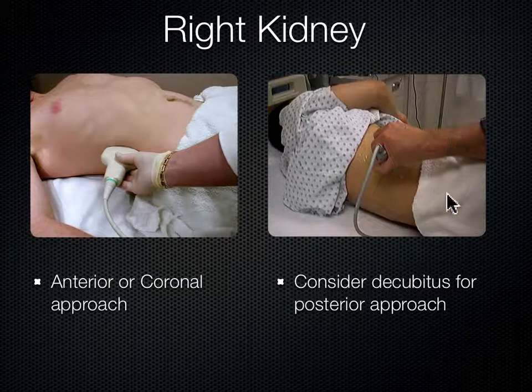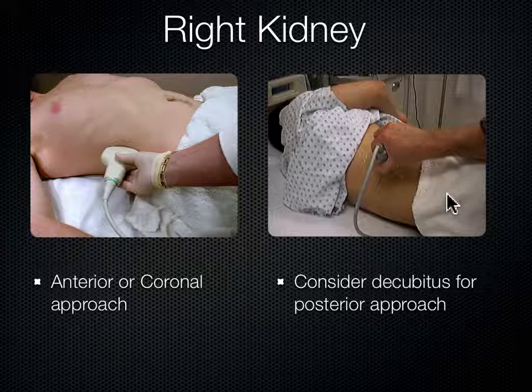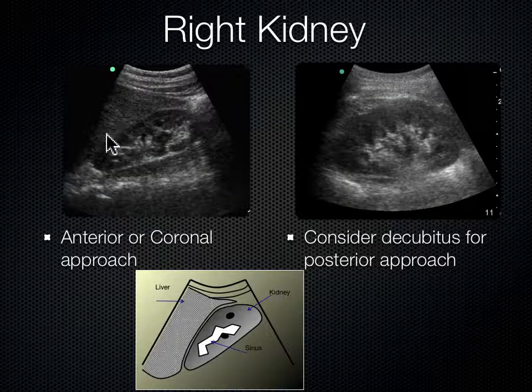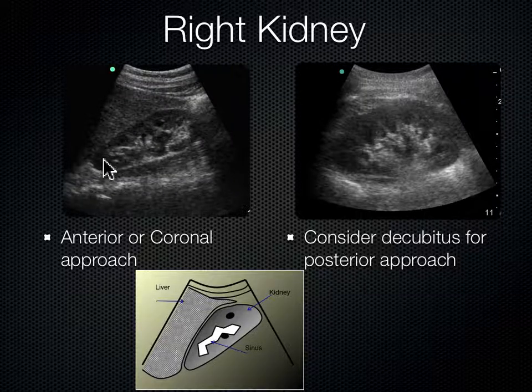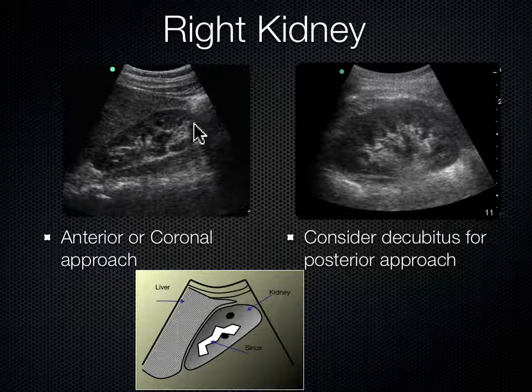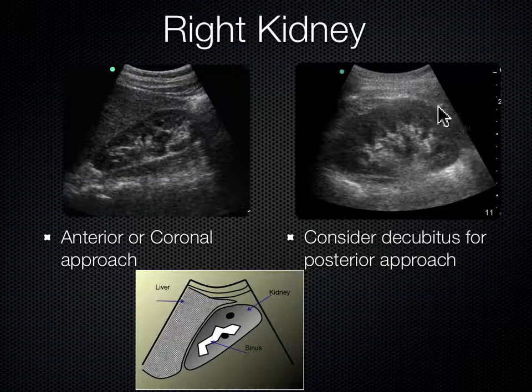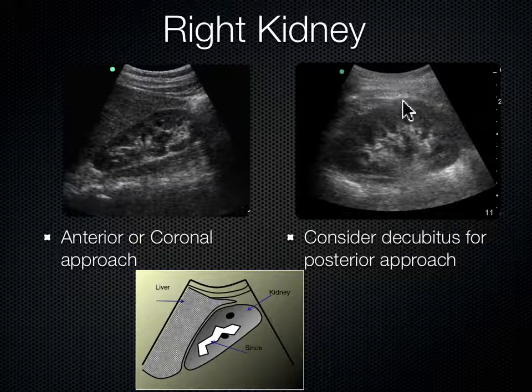If you can't get a good view anteriorly or coronally, you can roll the patient into left lateral decubitus — decubitus means on their side — and look between the ribs from a posterior approach. From the anterior or coronal approach we see the liver as our window to the kidney; going more posteriorly we see the psoas muscle behind the kidney, right on top of the spine. The anatomy from posterior to anterior is: spine, psoas, kidney, liver. The upper pole is more toward the head, then the mid pole, then the lower pole. In the decubitus position, the kidney can be as close as 2 centimeters deep to the skin on the posterior approach.